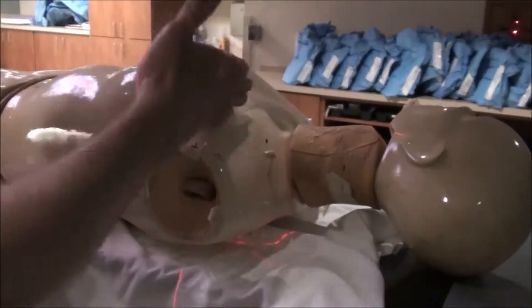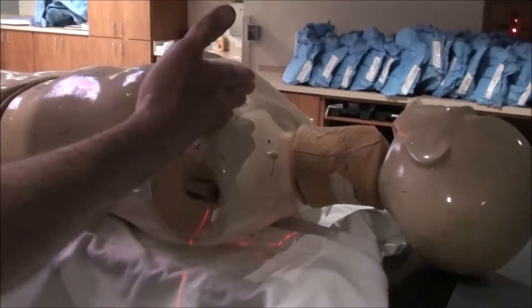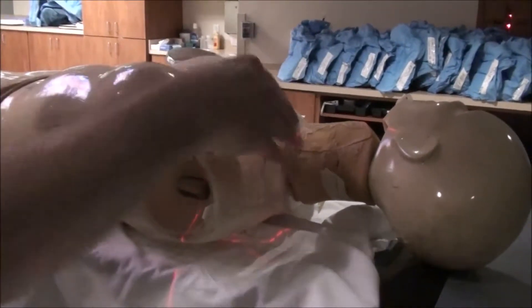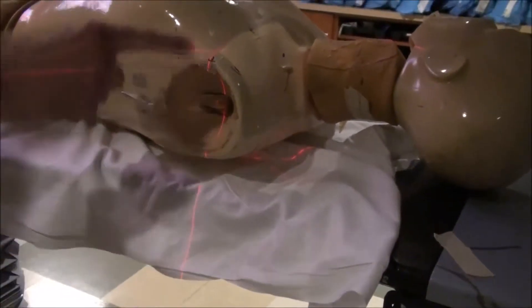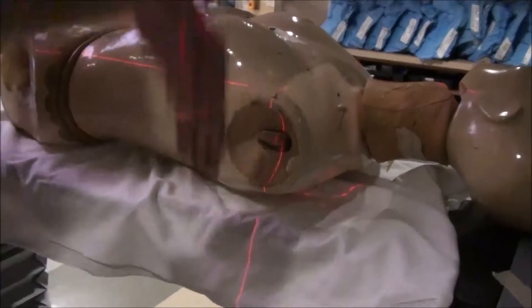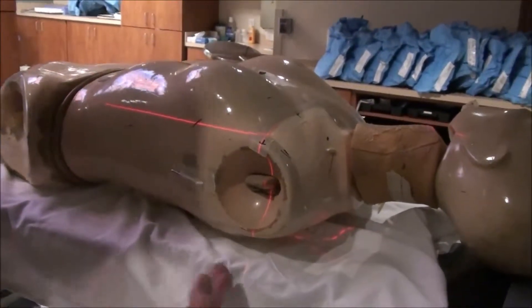You have a non-diverging inferior edge of the AP supraclavicular. That slices right down through the body, following that laser line right there. That's exactly what's going to happen — there's no divergence.